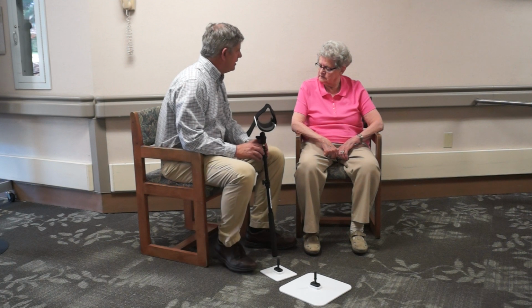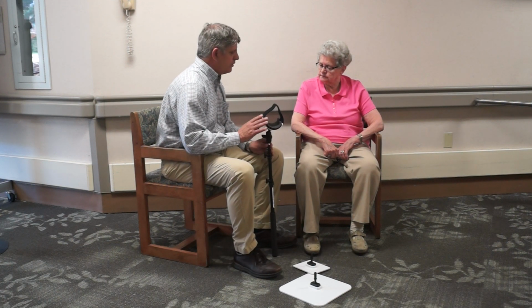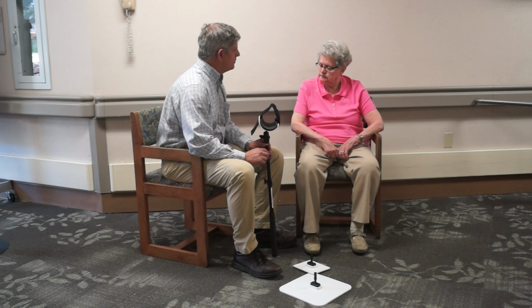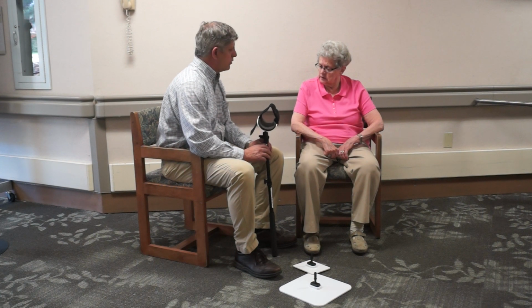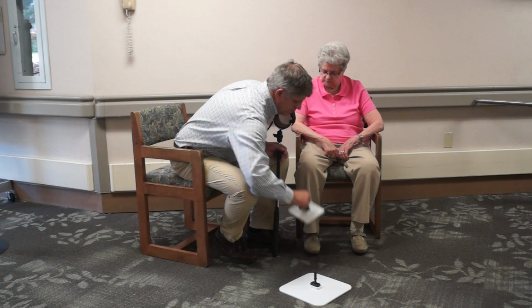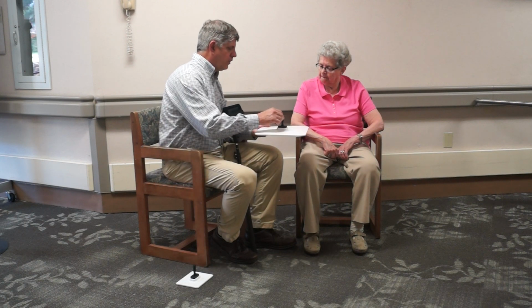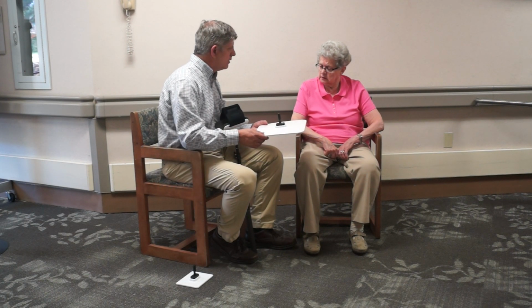So Audrey, this is the tool that we described in our last therapy session. And so what I'm going to do today is just introduce how we're going to use the tool to support the recovery of your shoulder motion, okay? So we're going to use this portion to begin with, and we have two different options here. We'll use this one a little bit later on because it moves the joint more, and this one we'll use first because it's more stable.